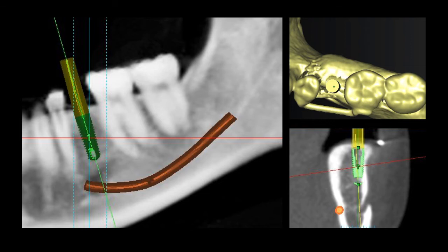It's going to be very difficult not to have a perforation in this buccal wall. Therefore, it was determined that I should move the implant slightly lingually while keeping the exit of the abutment to occlude the opposing arch appropriately. The cross-sectional view on the lower right is also utilized to measure on the software how much vertical bone we have and how much buccolingual bone we have and where exactly we're going to place the implant.